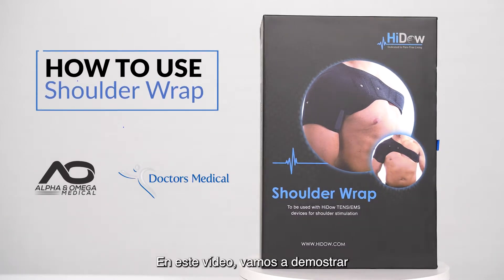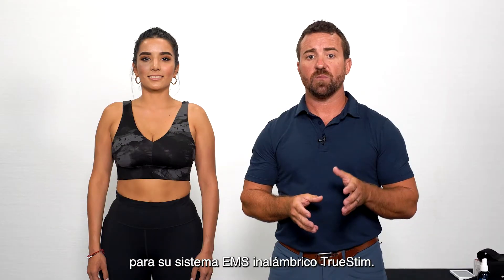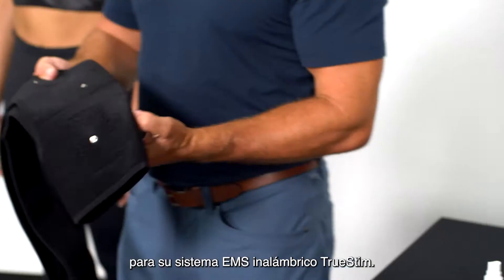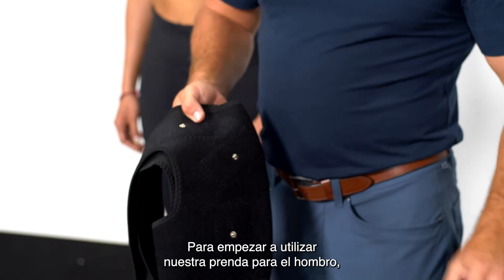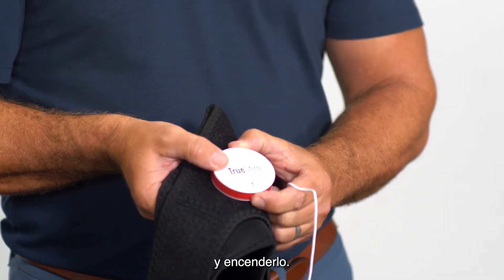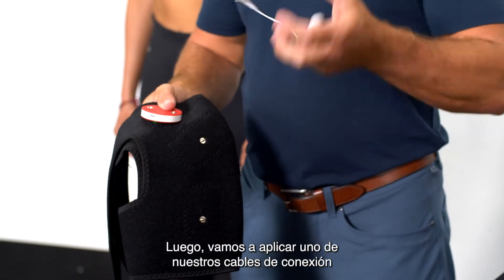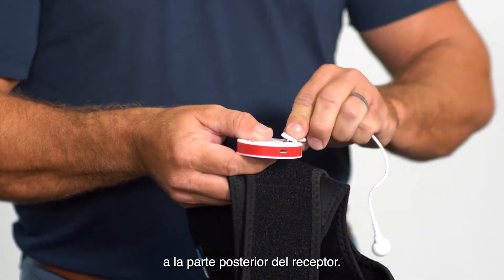In this video, we're going to demonstrate how to use the Shoulder Conductive Garment for your TrueStim Wireless EMS system. To begin using our Shoulder Garment, we're going to start with our wireless receiver and power it on. Then we're going to apply one of our connector wires to the back of the receiver.